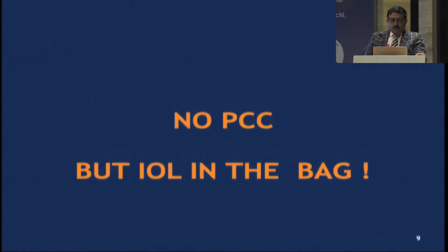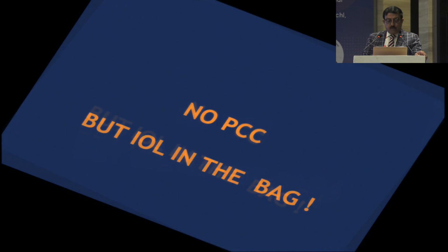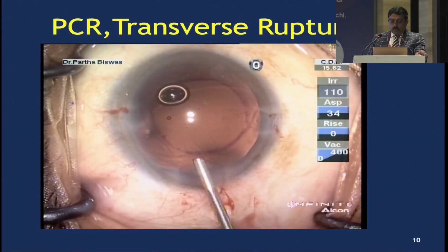So I'll go on to the last two videos of mine, and they are going to be similar to what Dr. Prakash also has shown, but I'm going to show you just one or two small tricks. With this amount of thought, if it can be done well, if you think your expertise is good enough, please do it.